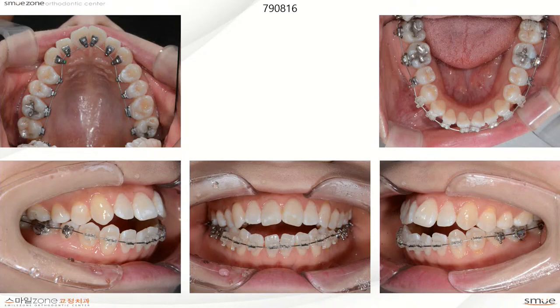This one is the lingual braces that I use nowadays, called alias bracket. So this is a passive self-ligation bracket, and it's very, very well made and very small profile, and I love it. Ормко. Yeah, Ормко. На верхней челюсти установлены брекеты компании Ормко, так как они маленькие по размеру и они самолигируемые.